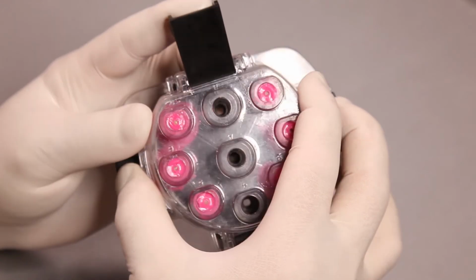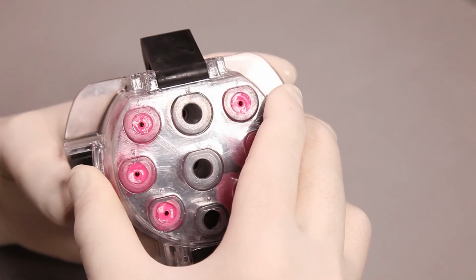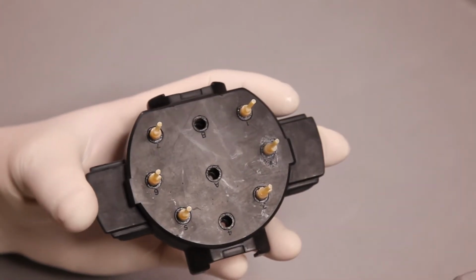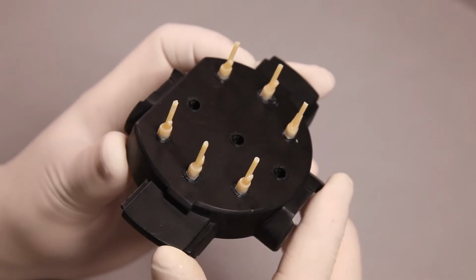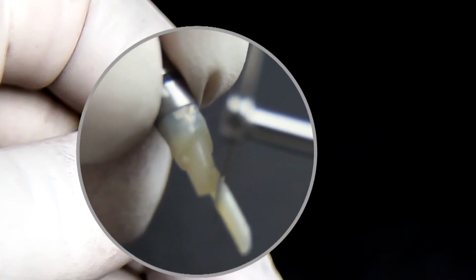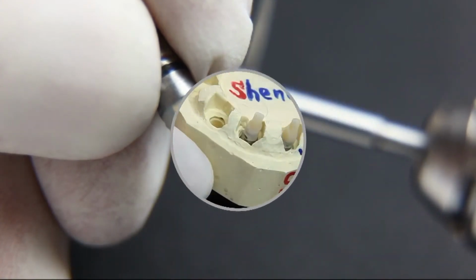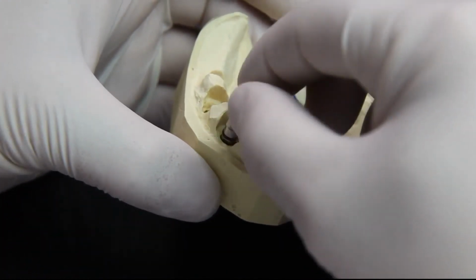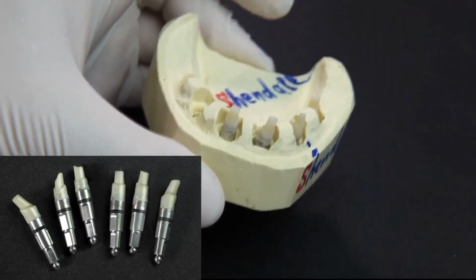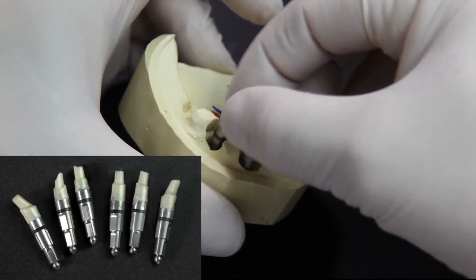After hardening of the composite material, the upper part of the box is removed again. Analogs with abutment duplicates are removed from the sockets in the lower part of the box. Funnels are trimmed and analogs with duplicates are inserted into the model. This insertion will always be simple and precise.